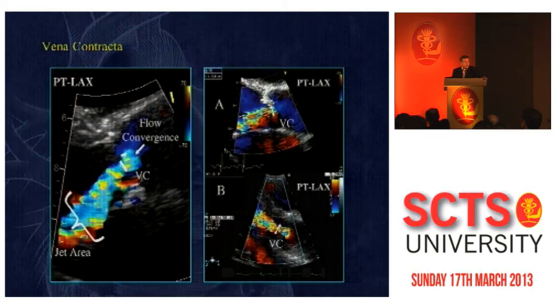When I measure left ventricular volumes in systole and diastole, I have their total ventricular output, so the antegrade and retrograde stroke volume simultaneously, and then I measure the PISA and I calculate the severity of aortic regurgitation by several means, and I try to see whether or not this works together, that the numbers do fit, because if they do not fit, there's probably a problem.